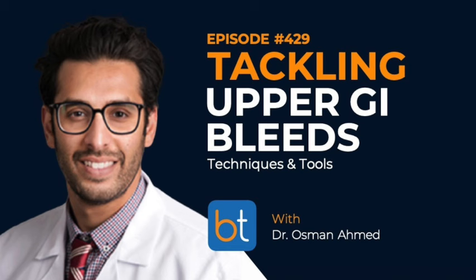I think so. A case like that would be excellent because there is some sort of definitive surgical management that's going to be occurring afterwards. You can pick and choose which vessels you think are ideal to embolize, so you have some choices there. Another good place is probably a GDA because it's such a long, straight vessel more often than not. I have not done it yet, but I've talked to some colleagues who recommend placing a distal coil to give it a little bit of a backstop and then lacing the entire GDA with the Obsidio.